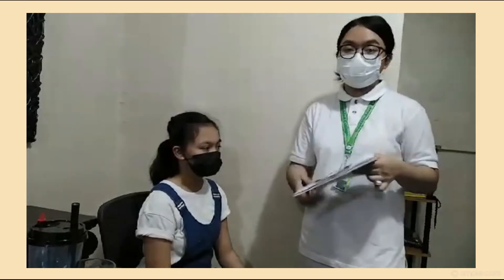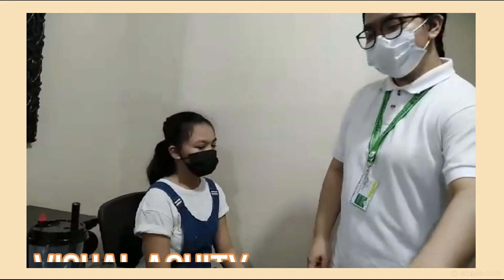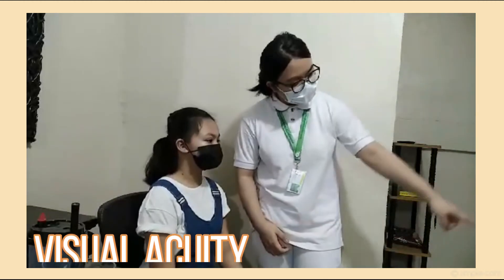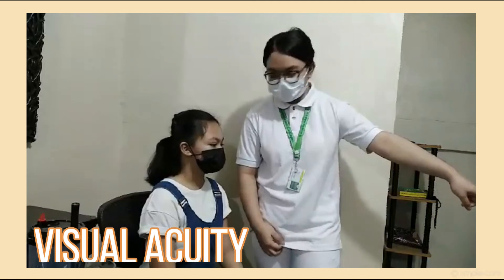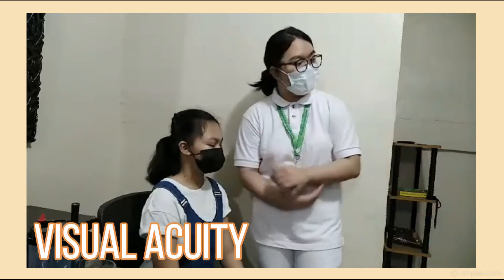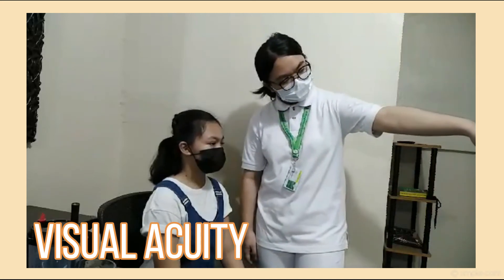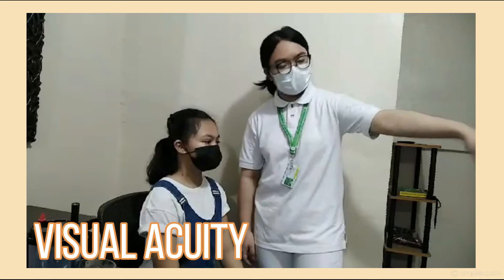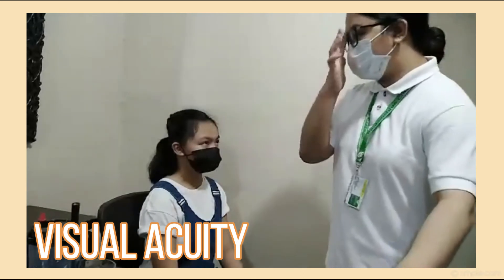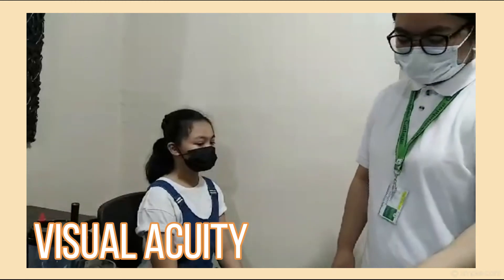Now we're going to assess the near and distant vision of the patient. Can you see what color that sofa is? Brown. Can you see what that is over there? Curtain. That is good. Now we're going to assess it as well with the Snellen chart.